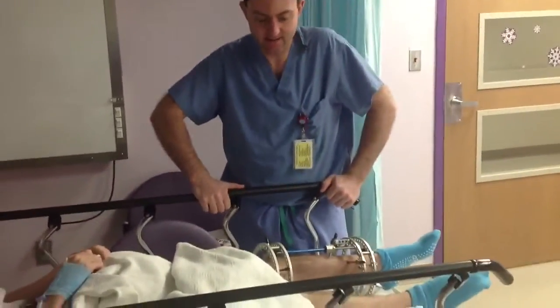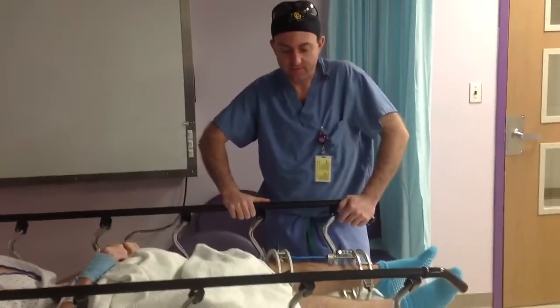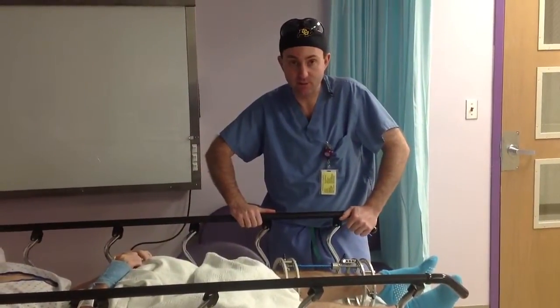Brendan finally made it to the end. He had undergone what we call a Ilizarov osteodistraction, which allows us to make bones longer.